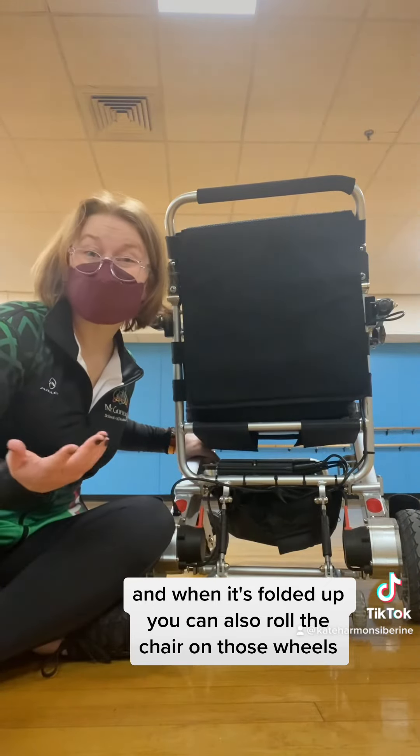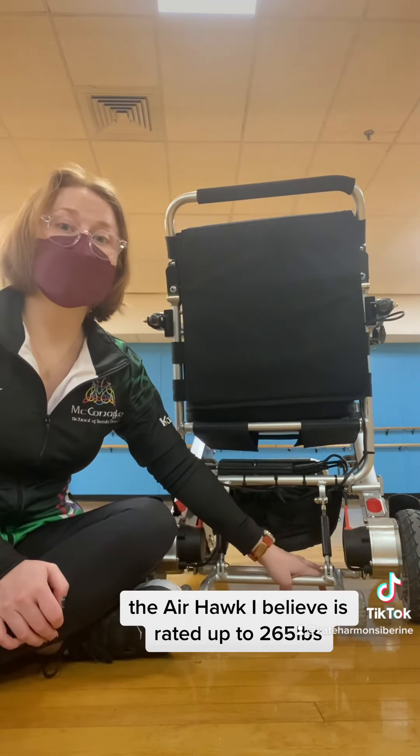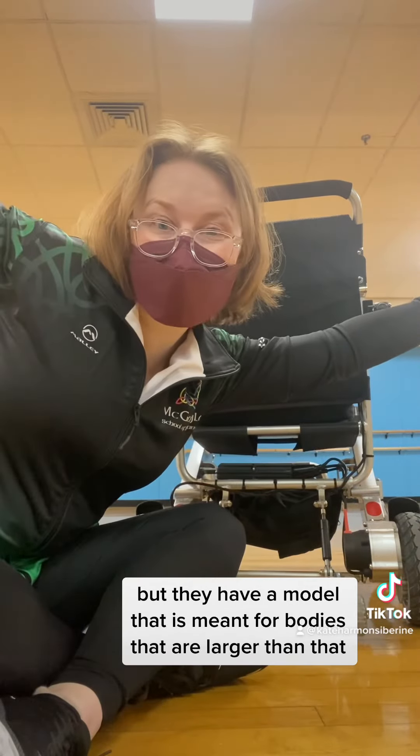The frame is made out of bicycle-grade aluminum, which means that it's really solid and pretty lightweight. The Air Hawk is rated up to 265 pounds, but they have a model that is meant for bodies that are larger than that. Ta-da — it's the Air Hawk!